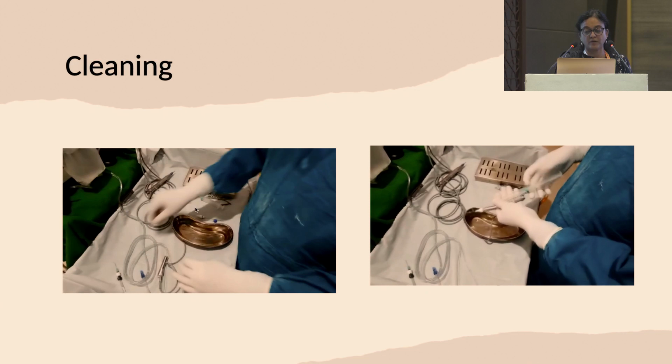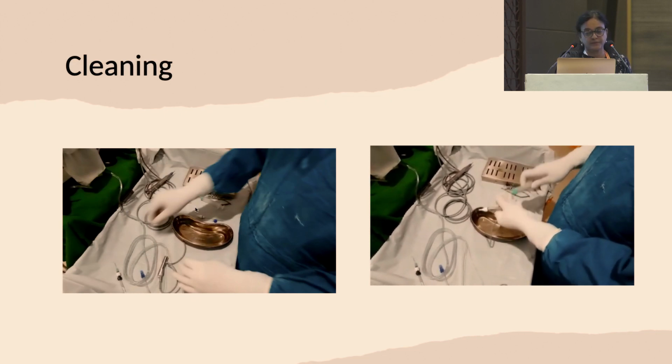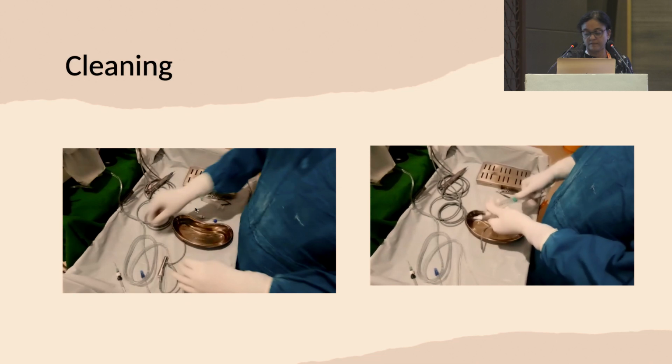If you have an autoclavable cutter, then this is sent for autoclaving. Both the tubings and the cutter are sent. If you don't have an autoclavable cutter, this is sent for ETO sterilization.